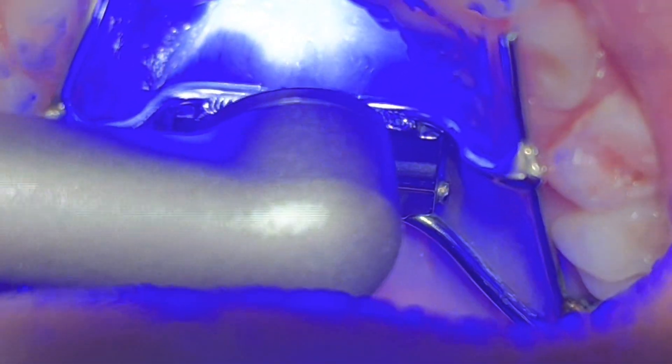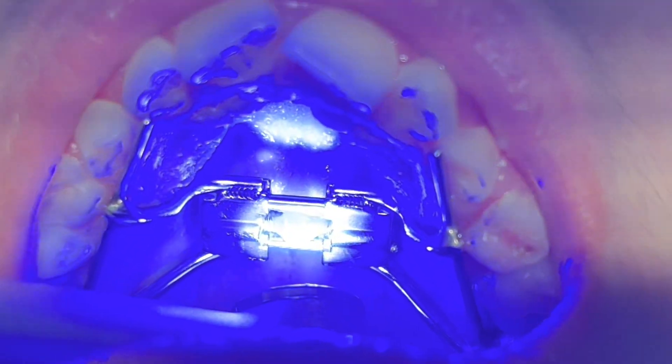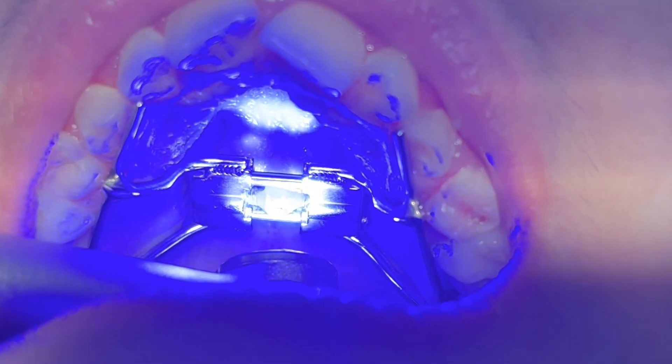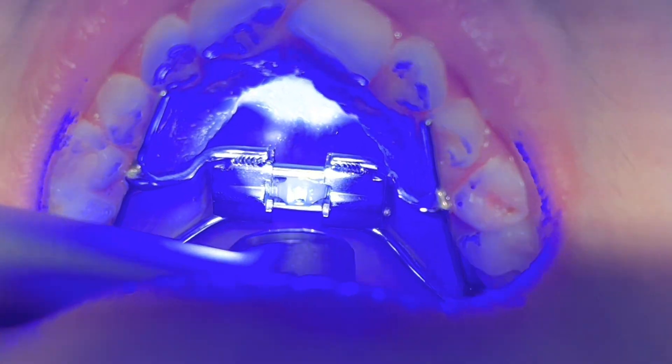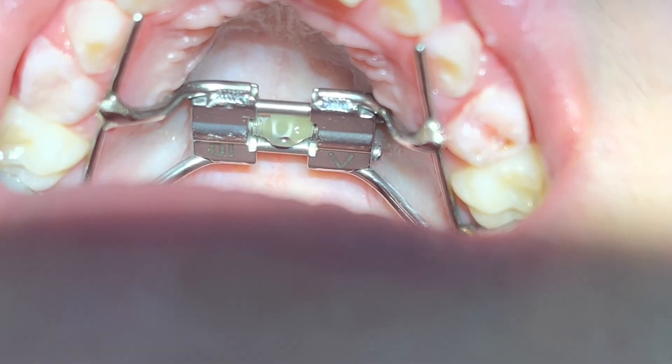To keep the expander clean and avoid any inflammation, it is very important to maintain a high level of oral hygiene by brushing with a dental brush, rinsing with salty water — and a water flosser is very helpful.